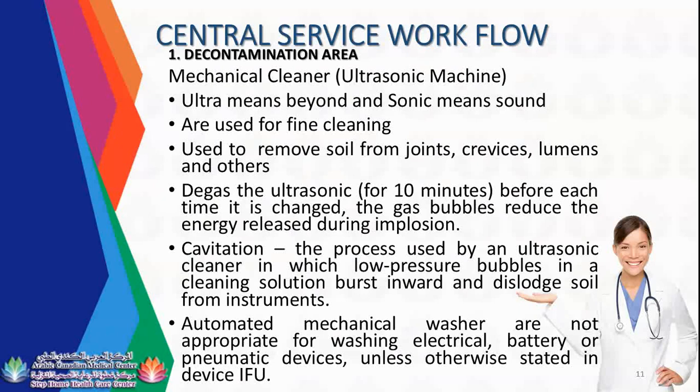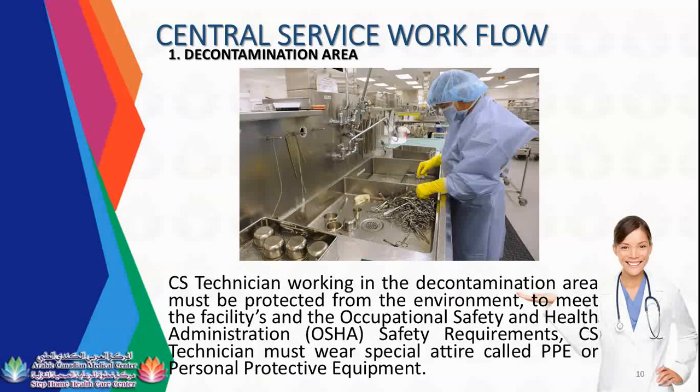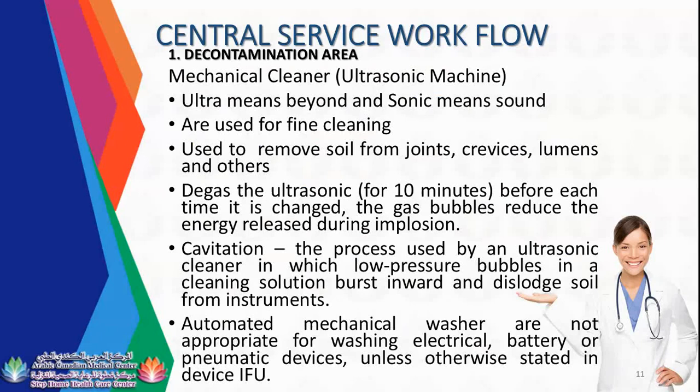Your first step in decontamination in this area, you will do the manual brushing. You will do it under the surface of the water. The second one, once you finish the manual brushing, you need to put the instruments for fine cleaning in the ultrasonic machine. The ultrasonic machine is used to remove soil from joints, crevices, lumens, and others.